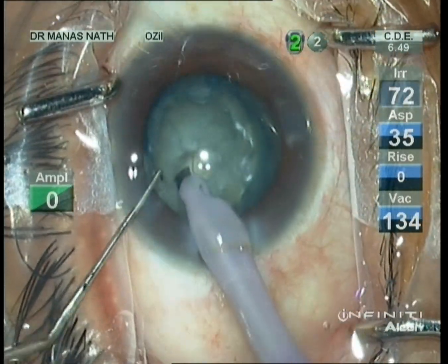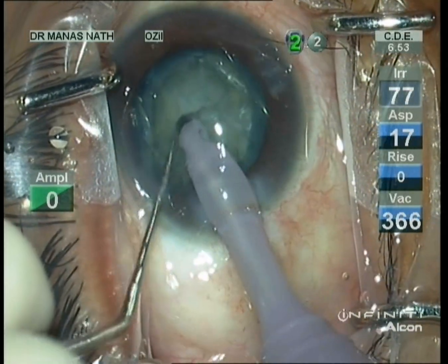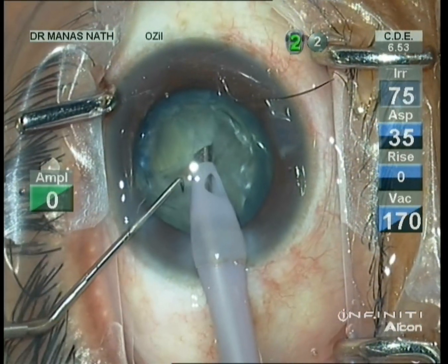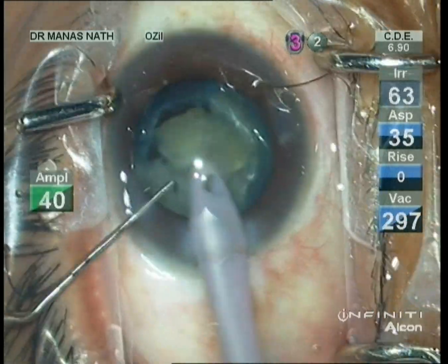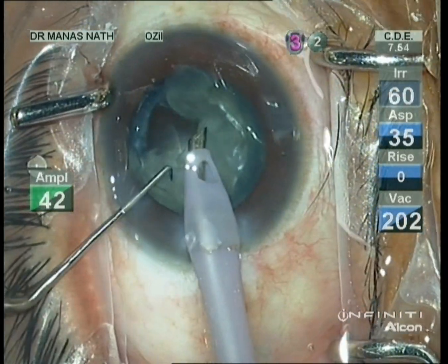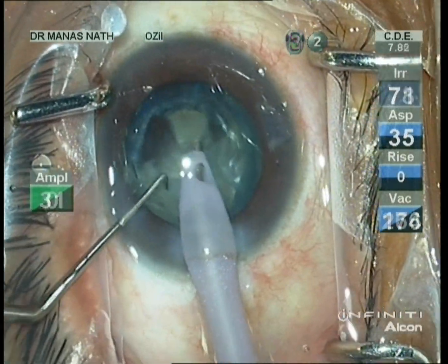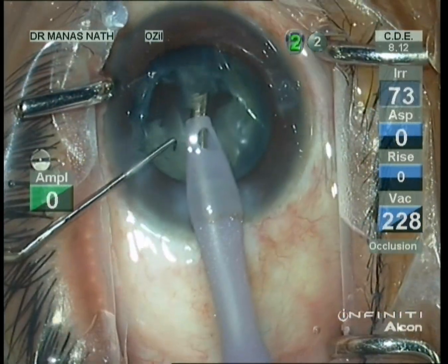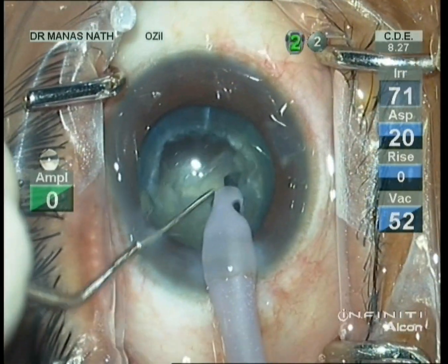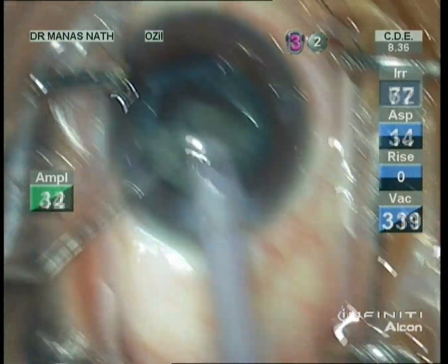Second chop done — one nucleus pie has been created. With a little tilt of the phaco tip, one can do the chops on both sides. You can see that almost half of the cataract has been chopped. This was possible because the capsulorhexis was of adequate size; in a small capsulorhexis this would have been quite difficult.